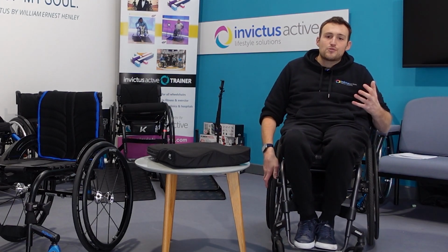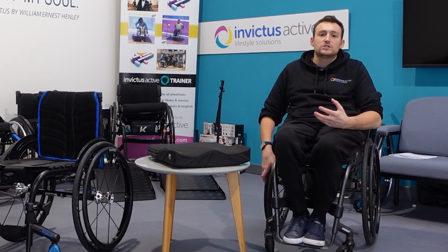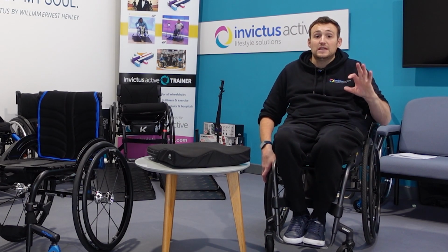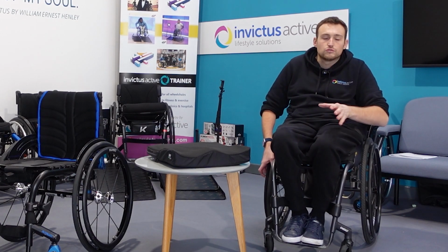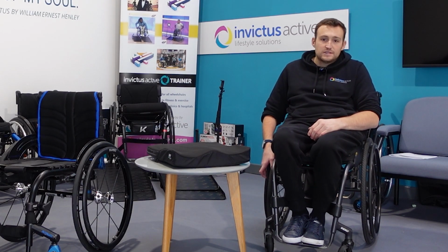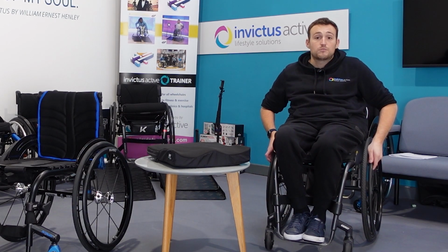Even if you haven't had a pressure sore before, if you're new to using a wheelchair or you're going to be using a wheelchair for a sustained period of time, the last thing you want to be doing is sitting on a small piece of foam. Over time, that's going to A, be uncomfortable and not have any postural support, but B, potentially risk a pressure sore, which is the last thing you want to do, trying to heal a pressure sore.